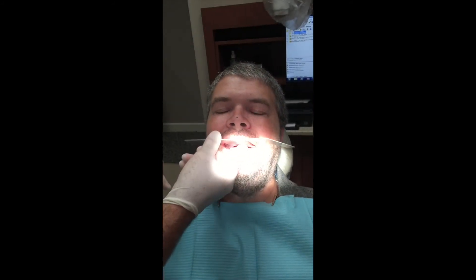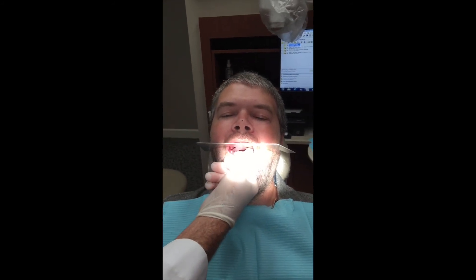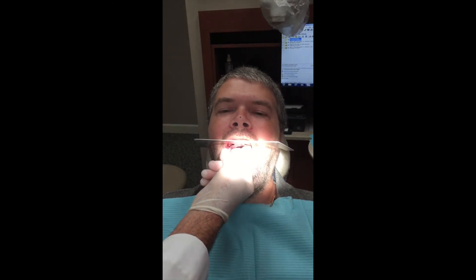One aspect that you're taught in dental school to use is called a Fox plane. With the Fox plane — open real wide — we look at this and make sure from the Ala-Tragus line on the side that it is pretty parallel. So that gives us the occlusal plane setting for the upper teeth.